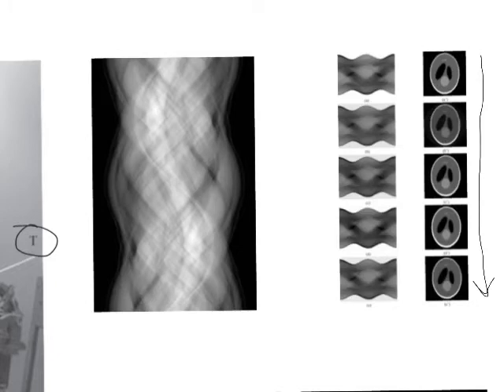If we've got some junk inside of something, some kind of iterative process is occurring. And I'll tell you what's basically happening. We have all these different attenuation profiles in the sinogram, like a slinky of data from spinning a tube around a cow brain and sampling it, and it's going to somehow combine it so I can see what's inside of that. So this sinogram is just a fancier way of looking at the raw data.